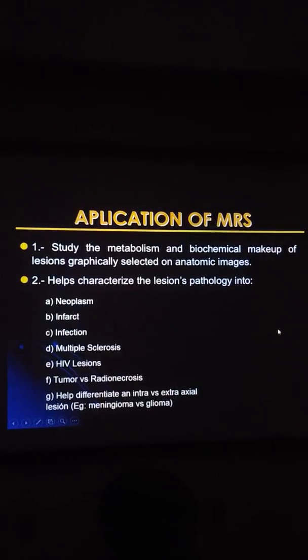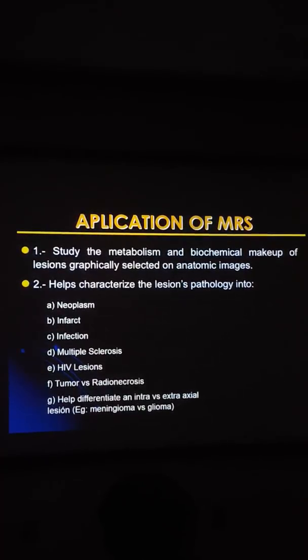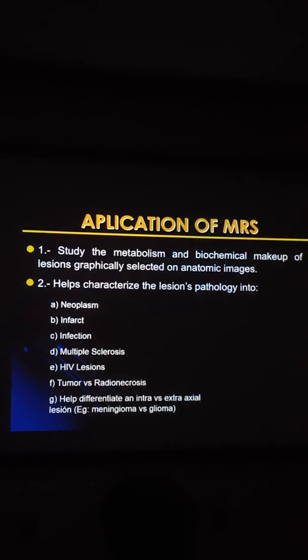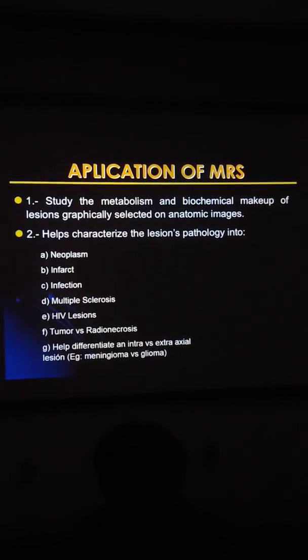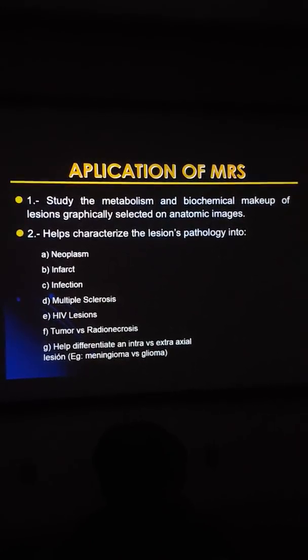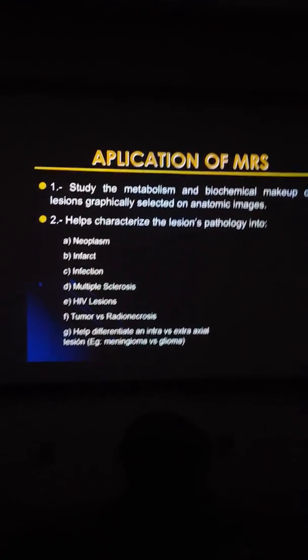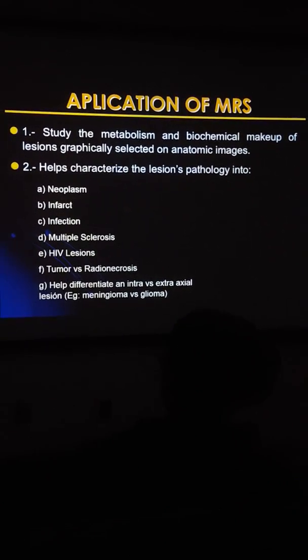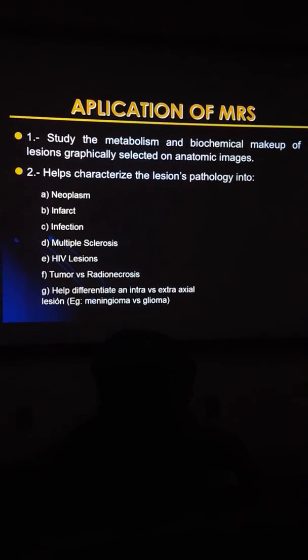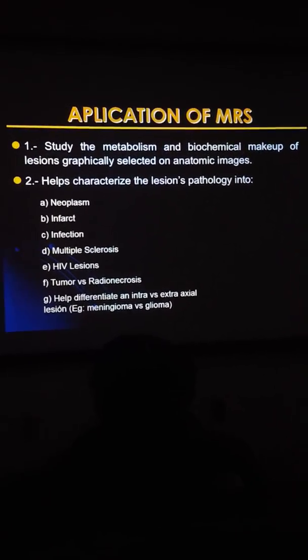So how we apply this in our clinical realm, we're using it in a very narrow fashion. We're trying to sort out different specific clinical questions that this technique helps us with. Like, for example, are we dealing with a brain tumor, or are we dealing with post-radiation necrosis? And this is a very big problem in neuro-oncology, because it determines if you're going to give more radiation to a patient if there is a tumor, or if you're going to be treating the patient with steroids and conservative management if this is radiation necrosis. And you can injure somebody really bad if you make the wrong decision.